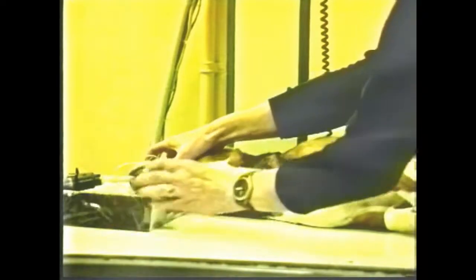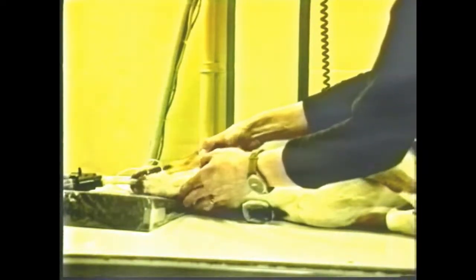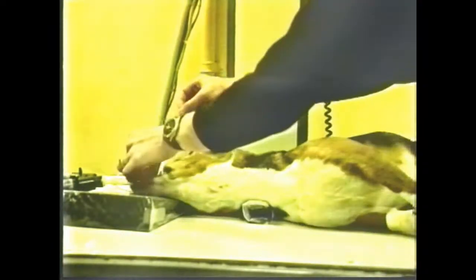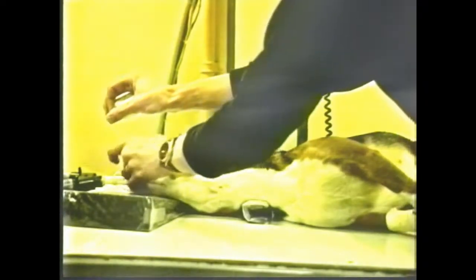The legs are taped and pulled back, and then a sponge can be used to prop up the head and control the cranial end of the cervical area. Sponges are then placed under the neck so that you can reduce the sag of the cervical spine. The wings of the atlas must be palpated to ensure that the cranial portion of the spine is accurately positioned. Tape can be placed on the canine teeth in order to apply traction to the head, thus reducing the sag of the cervical spine.